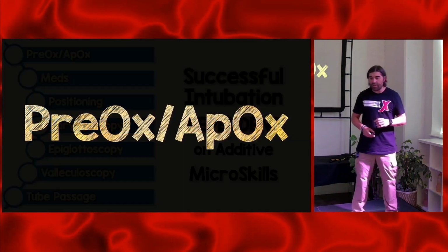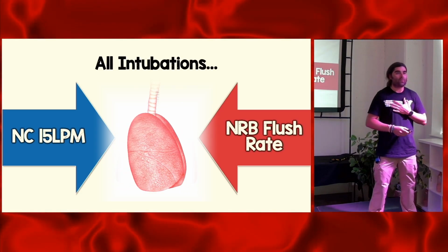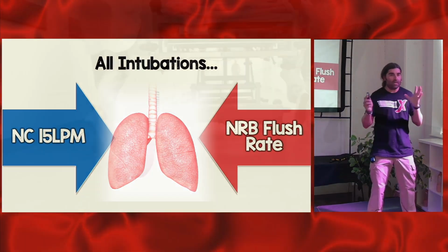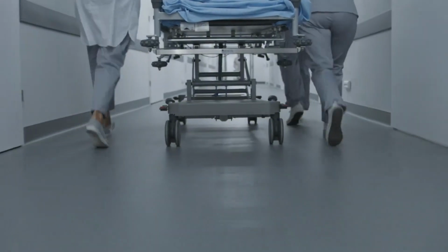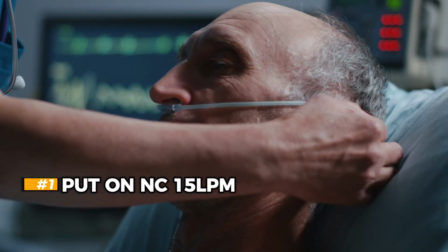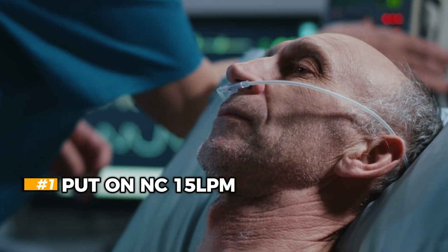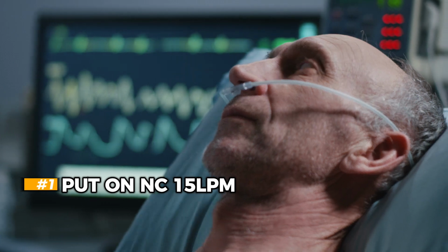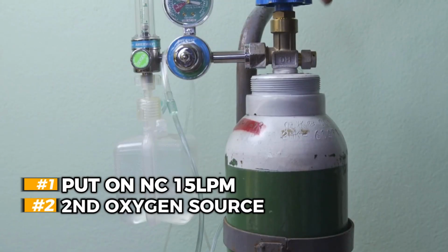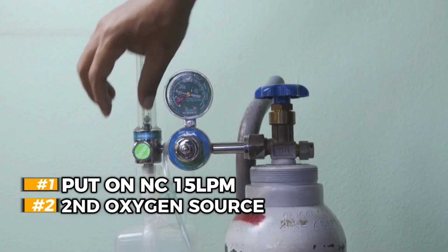So let's start with pre-oxygenation and apneic oxygenation. Now, I'll tell you what I do for all my intubations. Anybody who comes in who needs to be intubated, regardless of cause, gets put on 15 liters nasal cannula. I wish I could get my hands on high flow. Otherwise, I'd use high flow for my nasal cannula, but it's impossible where I work. So they just get on 15 liters and then I use a second oxygen source and I put the patient on a non-rebreather and I turn that up to flush rate.